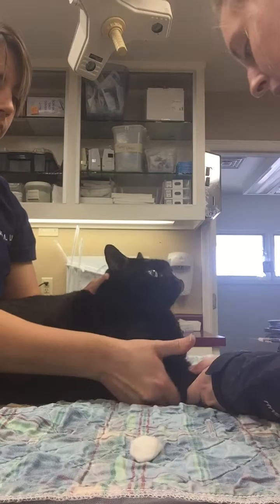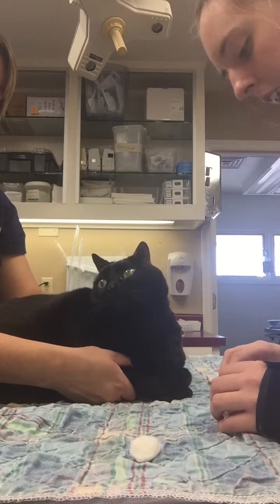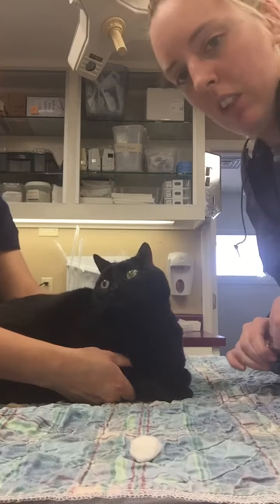Now I'm going to get my holder to hold off to create hemostasis. And that is a cephalic venipuncture.